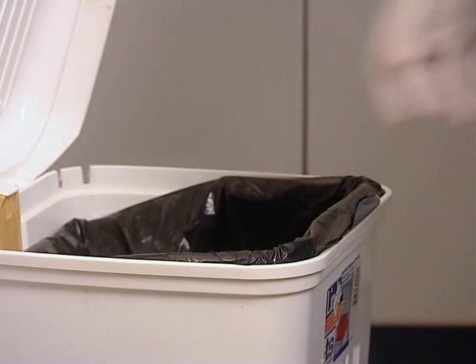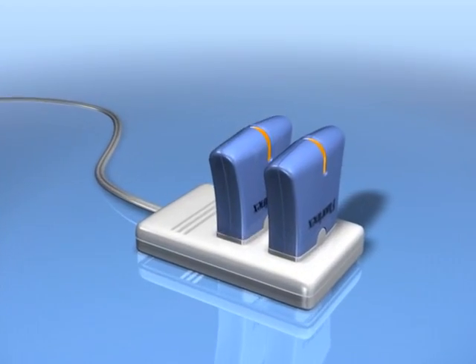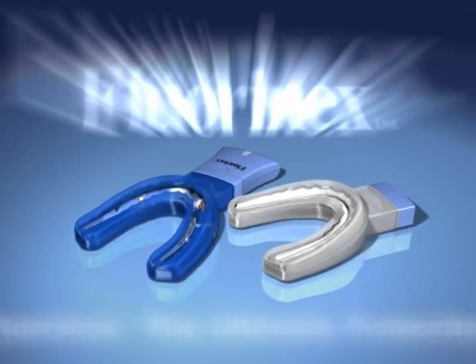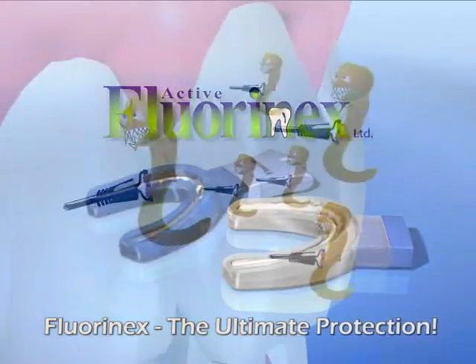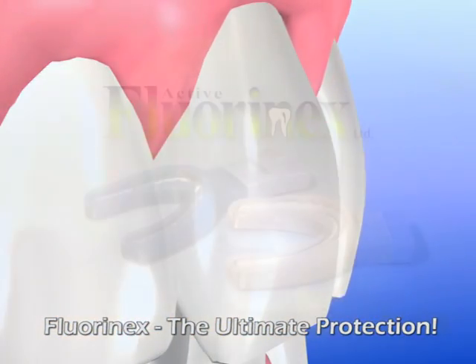The unit is disposable, and the mobile power supply is kept for recharging. Florinex's revolutionary procedure assures the most effective protection known today against dental caries.